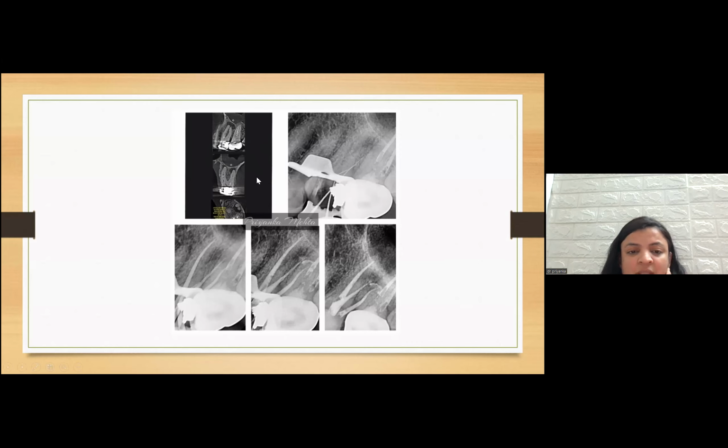We just advised a CBCT. There was this lesion formation. After checking the CBCT, I just opened up the tooth, negotiated the MB2 canal, and cleaned all other canals.